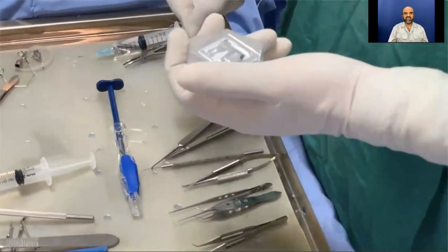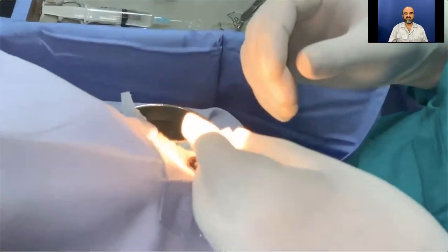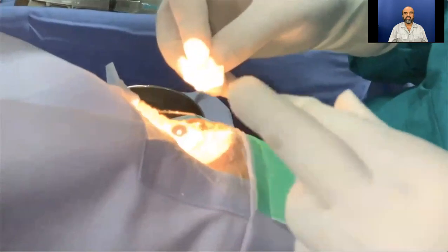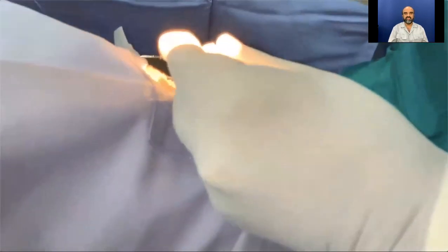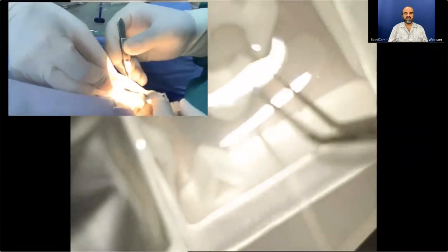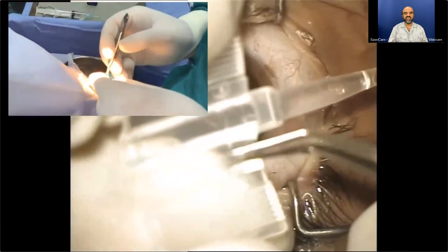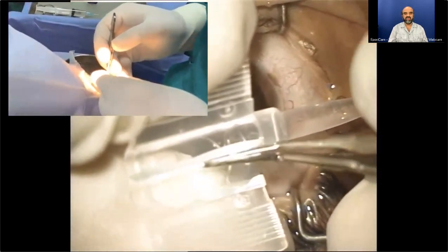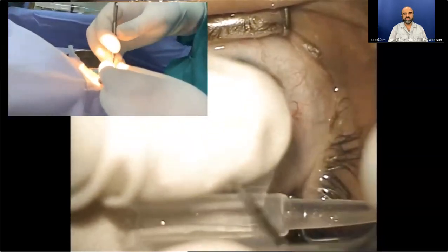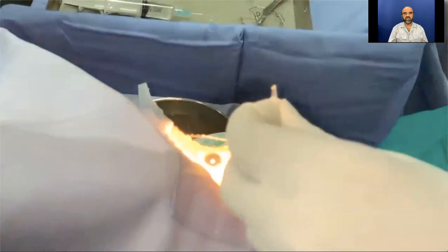The lens is supplied in a blister pack along with the Quantum ACE ErgoTouch injector. Presently being in the era of preloaded IOLs, this appears a little cumbersome to me. The blister pack is opened and the lens is handed over to me. With the help of my forceps, I place the lens inside the cartridge under the microscope, pressing it into the cartridge tunnel, and gently close the cartridge so that there is no haptic or optic catch.